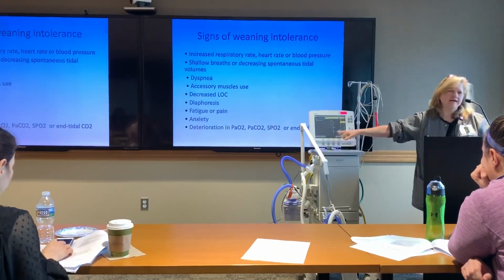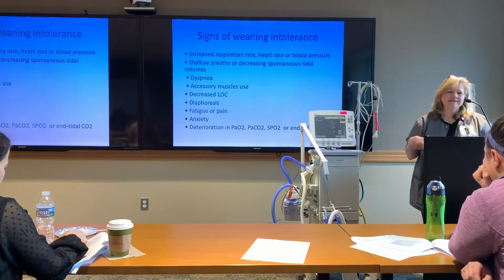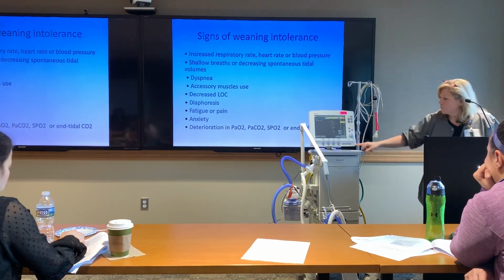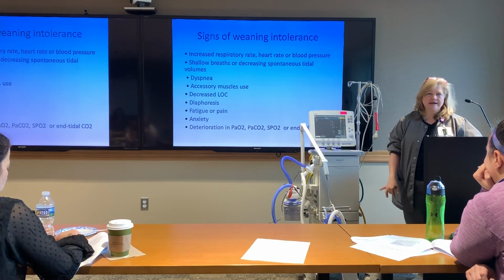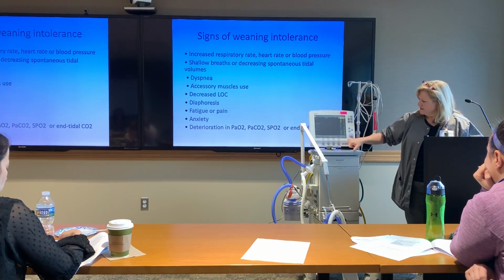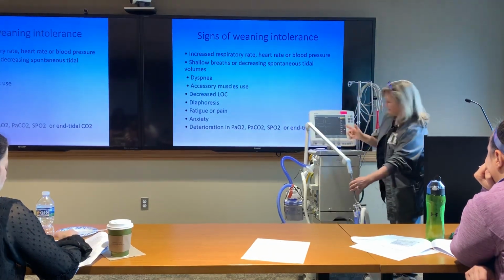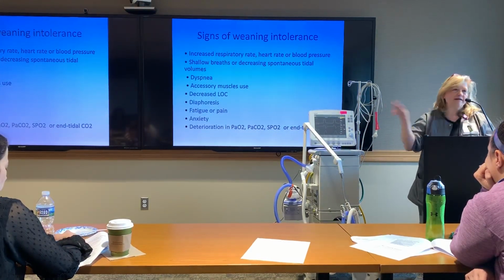All right, so this thing called SBI is another index that you can look at. If the patient's breathing spontaneously, you want that number to be less than 100, pretty much. It's not showing you much now because there's really been not a lot of spontaneous breathing in the hour here. The other place you can find it will be right here. If the patient does spontaneous breathing, it shows up on this screen. It's really more of a number to trend, okay?